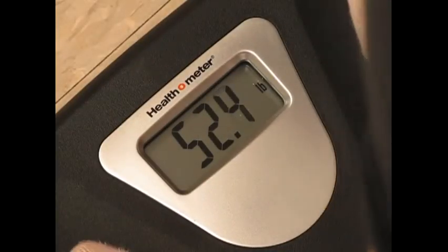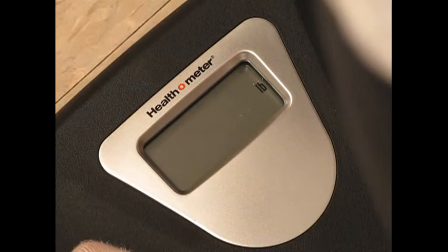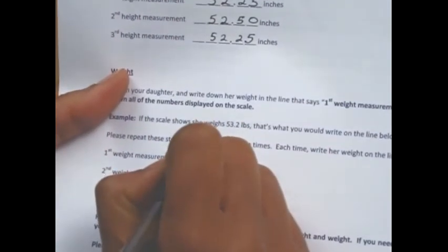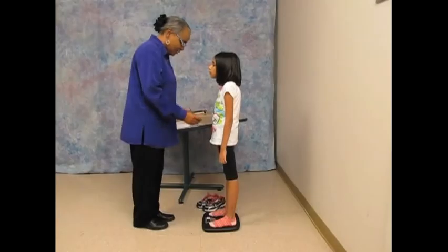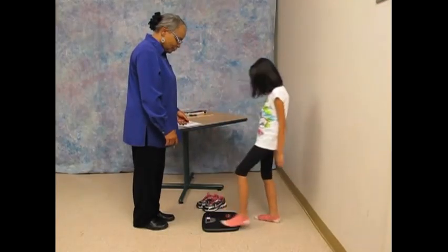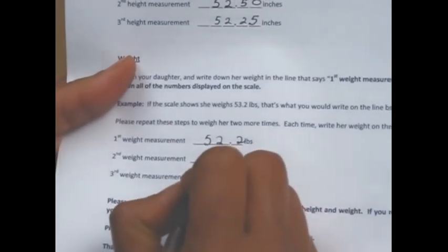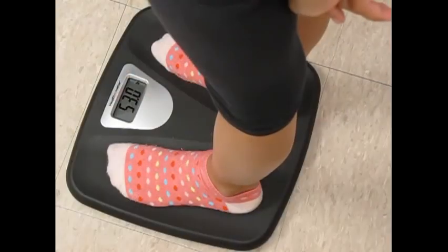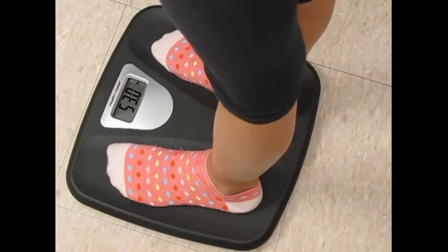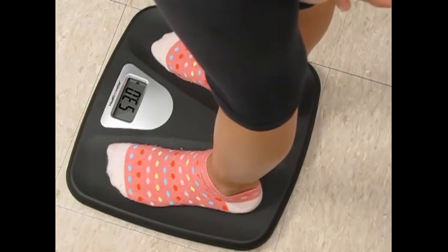When the numbers on the scale stop changing, write those exact numbers on the first line of the measurement form. This is your child's first weight measurement. Now, ask your child to step off the scale. To get the second and third measurements, repeat these steps and write their weights on the measurement form. Keep in mind, the numbers on the scale will disappear in less than 10 seconds after they stop flashing. If you're unable to record the weight before it disappears, repeat the steps to get a weight measurement.